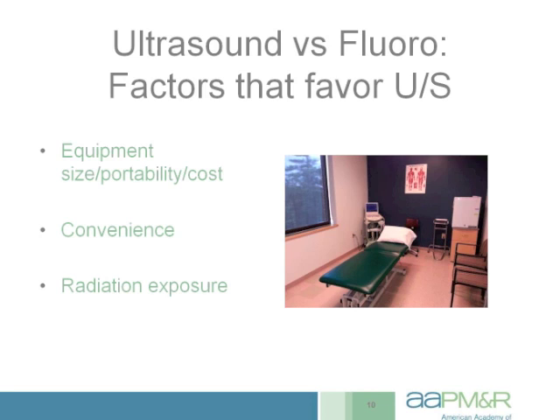So, factors that favor ultrasound versus fluoroscopy. This is actually a picture of my procedure room in my office, and you can see that the ultrasound machine is a lot smaller than a fluoroscope. It really tucks nicely into the corner out of the way when we don't need it. And it's quite convenient to use. It's something we can just roll forward to the bedside. If I'm just scanning a patient, I don't really need to have a lot of other people in the room. And it's something that I can turn on. It's ready to go quite quickly, and once the patient information is in the machine, we can be up and running very fast.